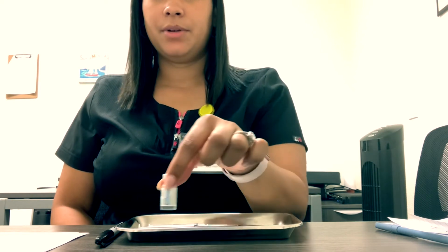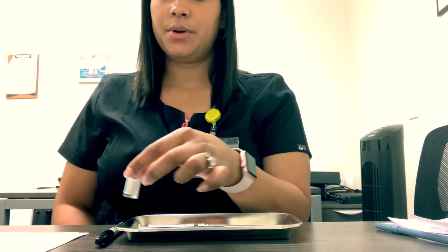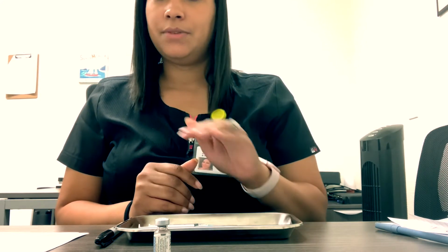Storage after first puncture. After this vaccine has been punctured, this vial can either 1, stay at room temperature for 2 hours, or 2, be returned to the refrigerator for 6 hours. So, this vial will give you 5 doses of 0.5 mL. So, you will draw up your 5 doses under 30 minutes, and then you will return them to the refrigerator for 6 hours without having to subtract the 30-minute draw time. Or you will draw up all 5 of your doses. Say it took you 30 minutes, then you have an hour and 30 minutes left to administer those doses. So if you're just leaving it at room temperature, then you have to subtract the prep time. If you are returning it to the refrigerator and you prep them under the 30 minutes, then you can just go ahead, put them in the refrigerator, and they are good for 6 hours.